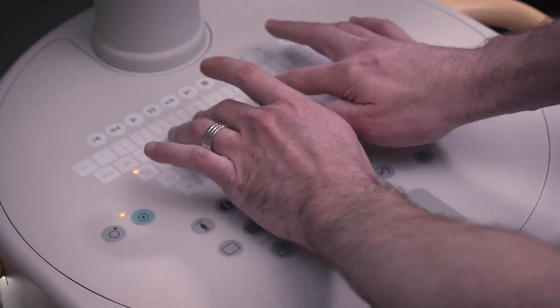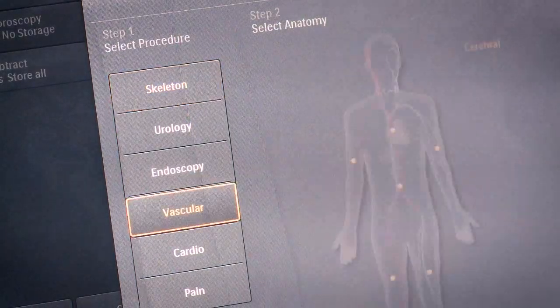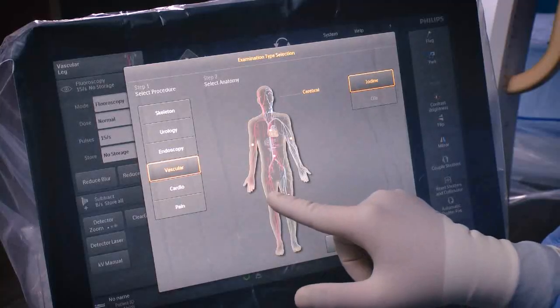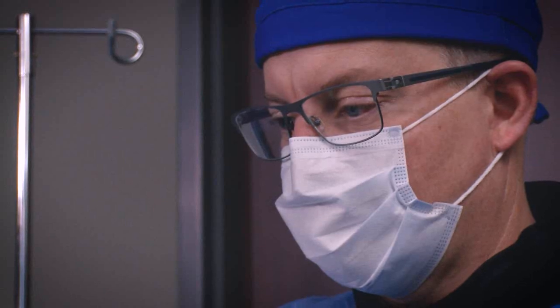The unit in terms of putting in patient name and information is a very easy system. It has several different presets, and the interface with the flat panel screen allows me to basically touch one or two buttons and get the images that I need.